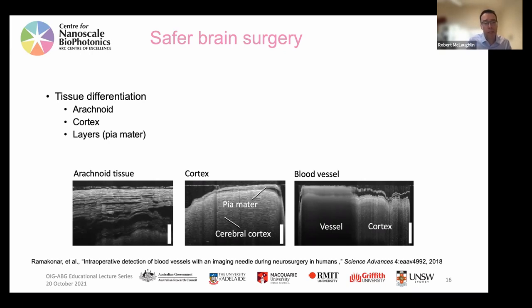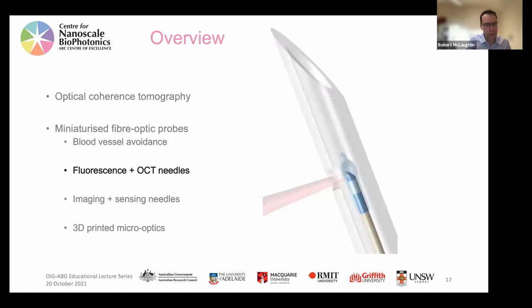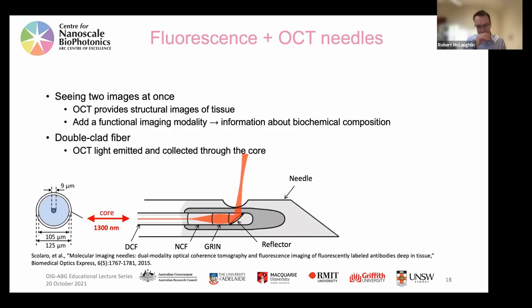So with OCT for any particular application, always keep in mind, you've really got to try it, and it matters on the optical backscattering properties. Some tissues you can really differentiate. There's a whole lot of tissues you can't. So there are only some applications this technology is useful for. So let's take that a little step further. Now that we've got OCT fiber probes we can put into needles and image things with, often OCT can't tell us the whole story.